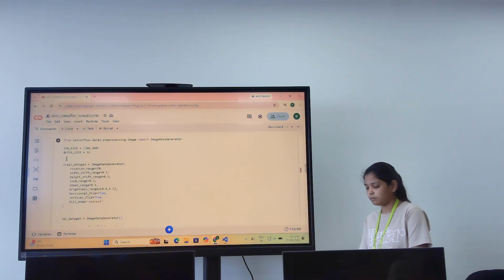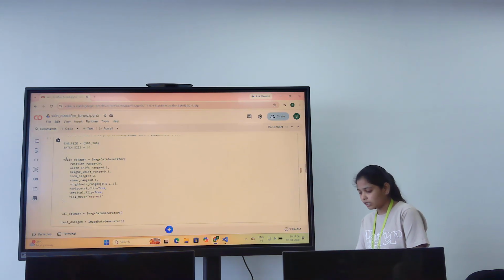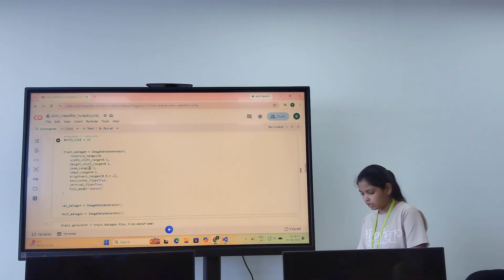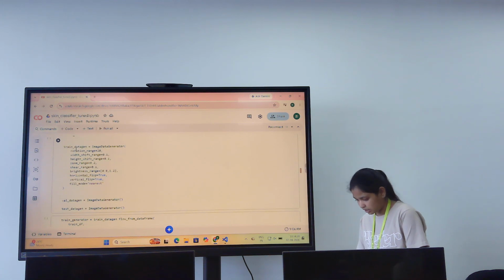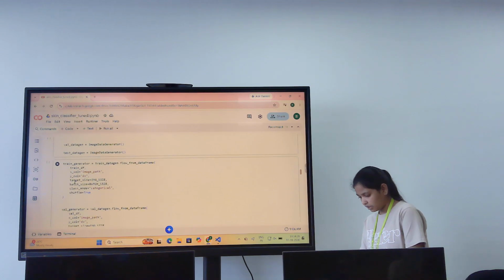Here I did image pre-processing: all the images are resized to 300 by 300 RGB, and I also did data augmentation to improve generalization and reduce overfitting. I include rotations, shifting, zooming, and horizontal and vertical flipping for the training data.